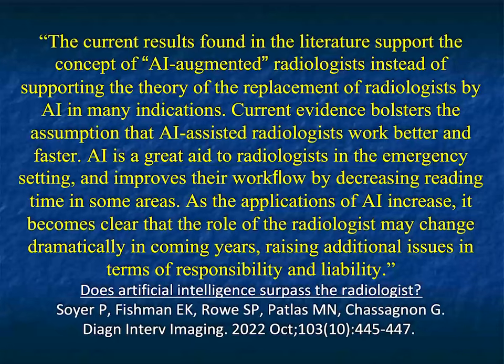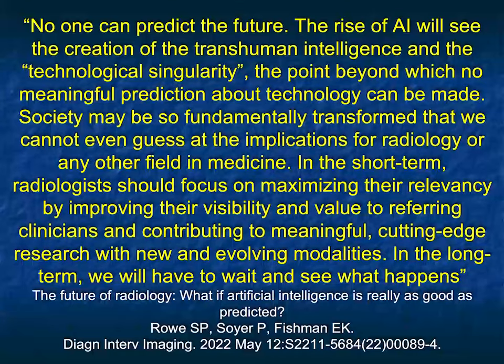Now, can AI do better than the radiologist? Someday it's true. I think for the foreseeable future, you're going to have AI assisting the radiologist. Remember, we've said before, do not resist AI. Embrace AI, but have it work with you. And hopefully together, the radiologist and AI will do best for our patients.